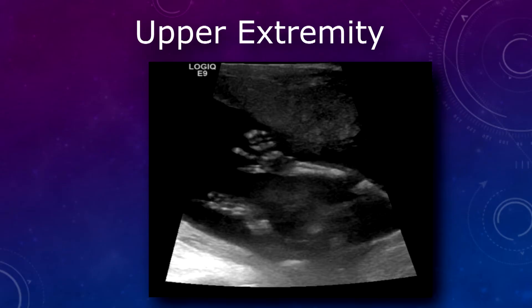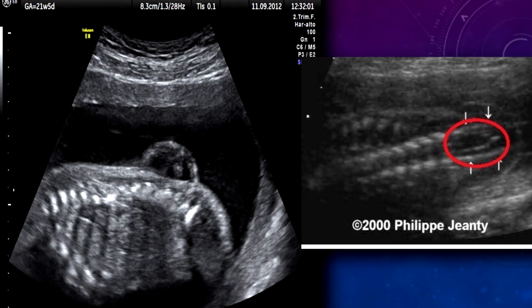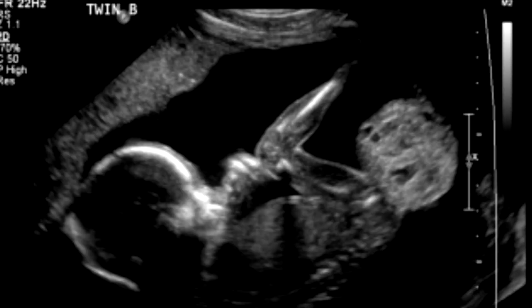From here, you may proceed to do the upper extremities or the spine — it really doesn't matter which you do first. For the upper extremities, you need to make sure you get the humerus, radius and ulna, and the hand showing all the fingers. Once you go to the spine, you would want to take sagittal images of the cervical, thoracic, lumbar, and sacral spine. You can also get coronal and transverse views. You can rule out things like spina bifida at the spine, and at the sacral region things like sacrococcygeal teratoma.